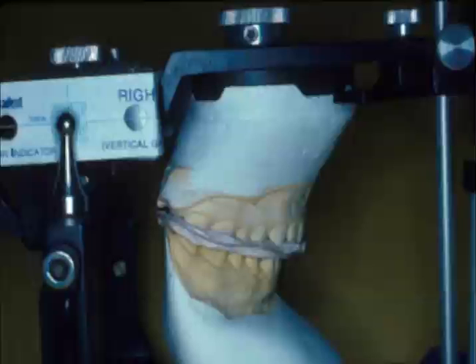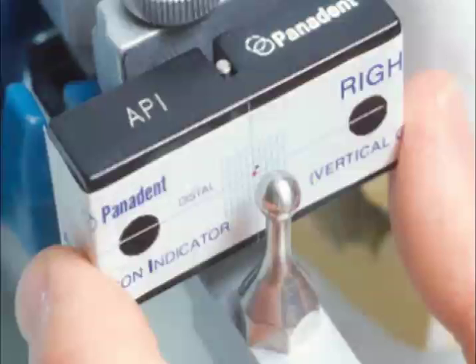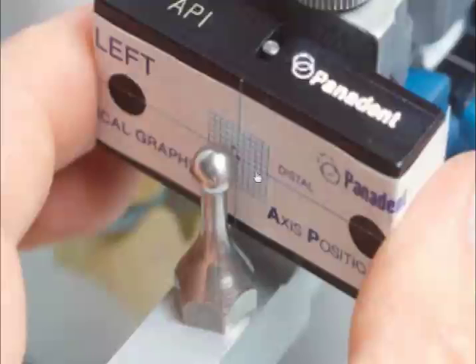So what we wanted to see is where's the condyle going during splint therapy. So we'll mark that with a different color. And we can see on the patient's right side that the condyle has moved up about 1 millimeter and forward about 0.5 millimeter. On the patient's left side, it's gone up a little over 1 millimeter and gone forward about 0.75 millimeter. And we can do this weekly until we achieve the points at the same position, verifying a stable condylar position.